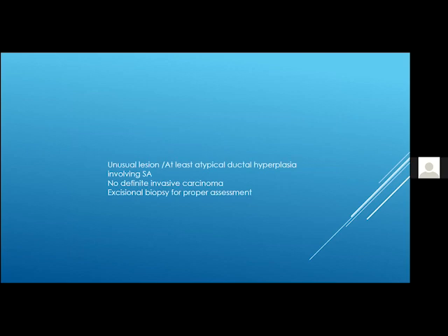To give a definite diagnosis is a little bit difficult, but I thought at that time, this is atypical ductal hyperplasia, at least, involving sclerosing adenosis, with some comment about that area which looked like adenoid cystic, but actually with other immunos did not support the diagnosis of adenoid cystic carcinoma. As you can see, there is no definite invasive malignancy. There's nice myoepithelial lining, and we said excisional biopsy for proper assessment.